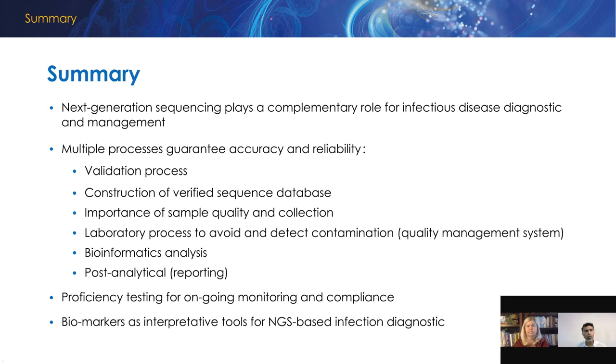If the specimen is not a good quality sample or wasn't collected with a good technique, we risk identifying organisms in the sample that don't come from the site of infection. And this is probably one of the biggest areas where, as a microbiologist or laboratorian, especially implementing NGS, we should emphasize to clinicians and providers that the sample collected and submitted needs to be a high quality sample, collected with the best technique possible. Because in that way, the interpretation and the use of that result for clinical utility or clinical management can be guaranteed.